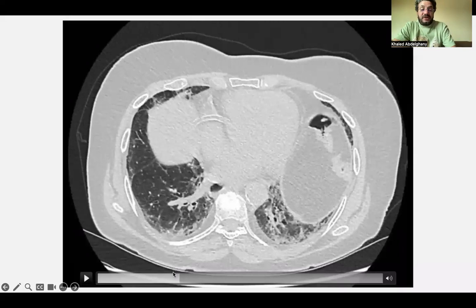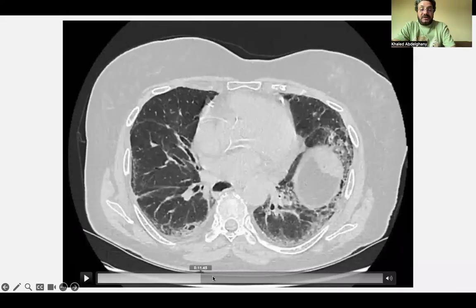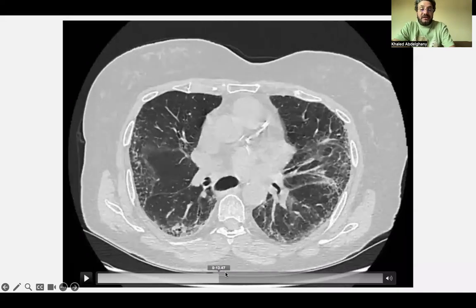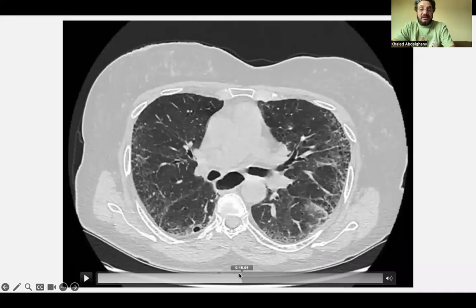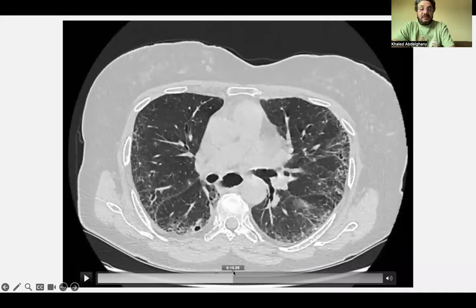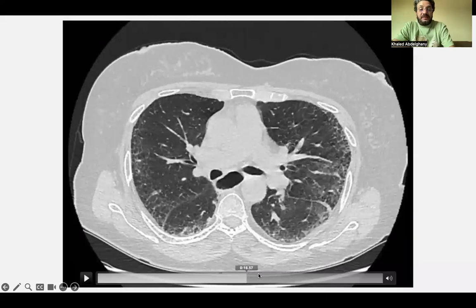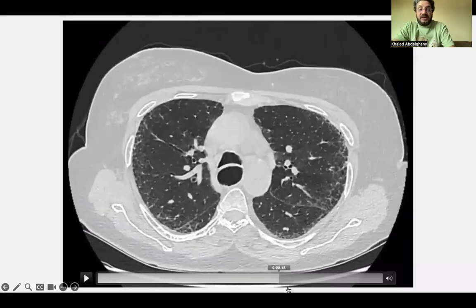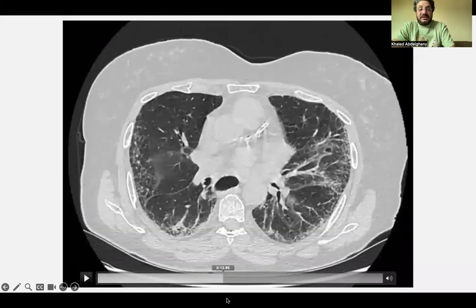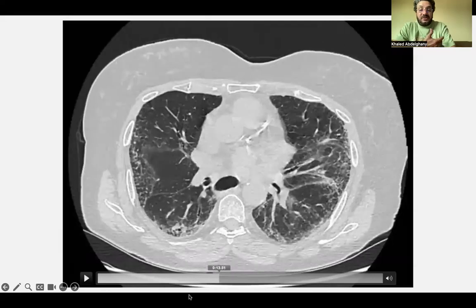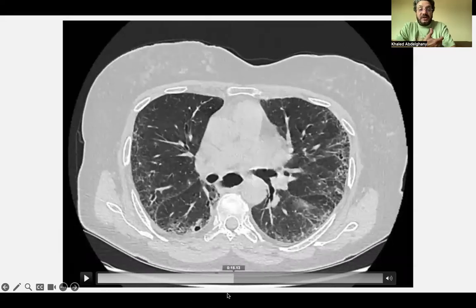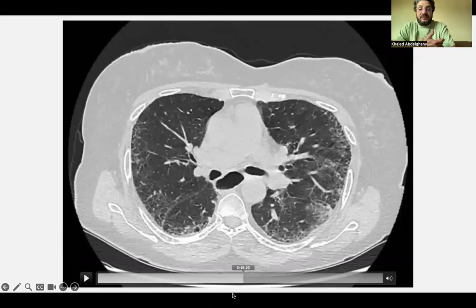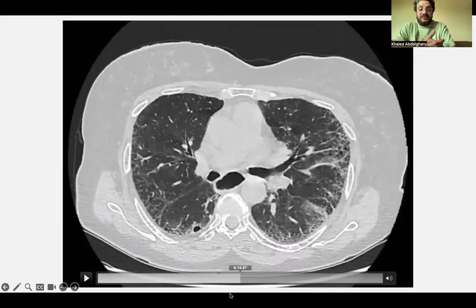But when proximal and central in the lung, it is normal — almost normal — and this is the majority. Nothing is 100%, but collectively you judge it collectively. Collectively, the abnormality of fibrosis is confined to the periphery. No bronchocentricity.